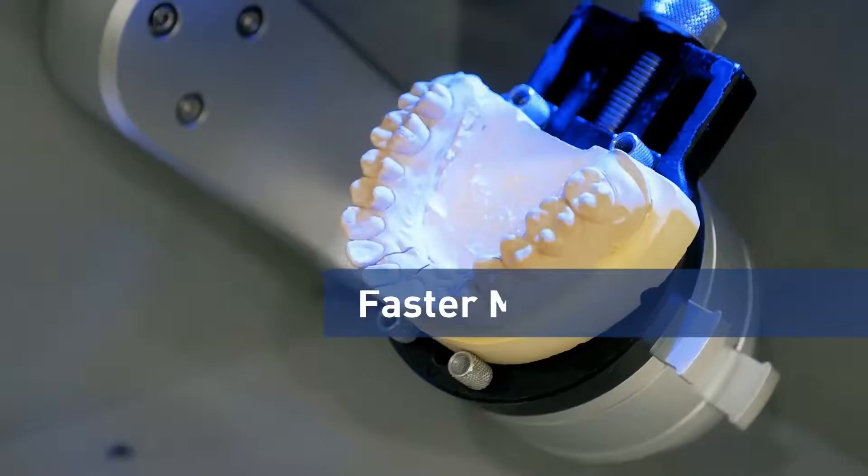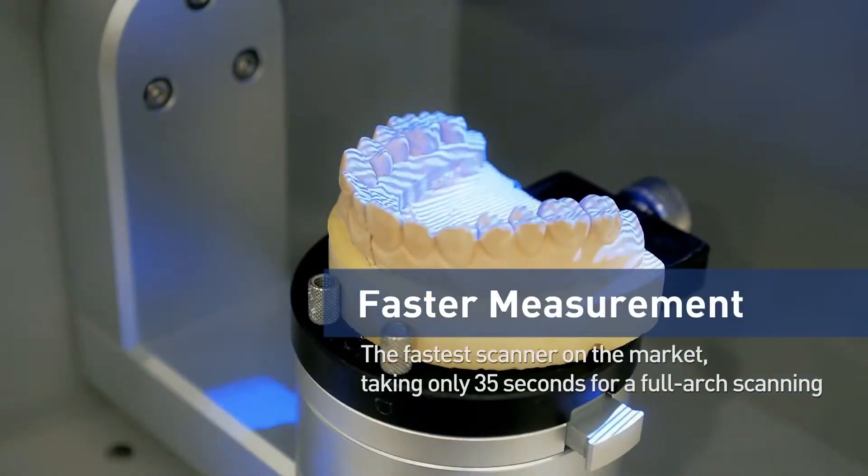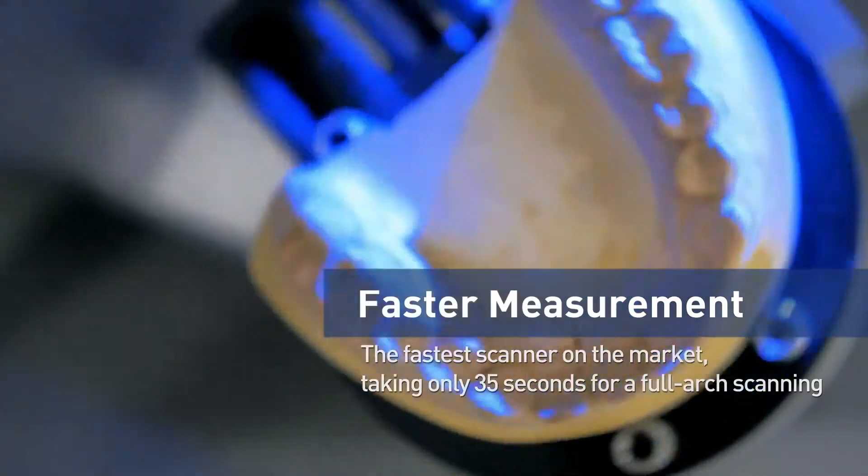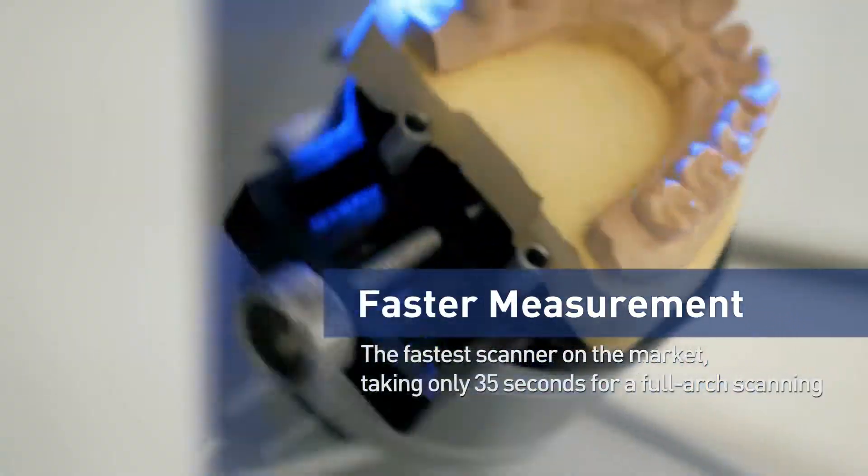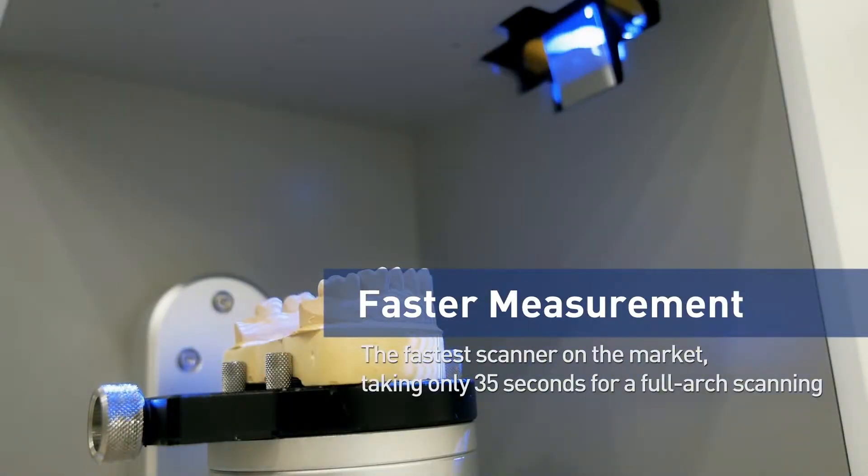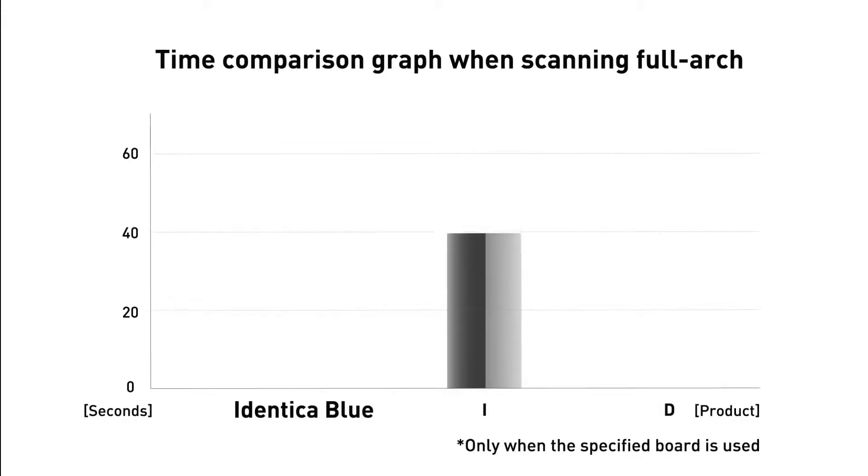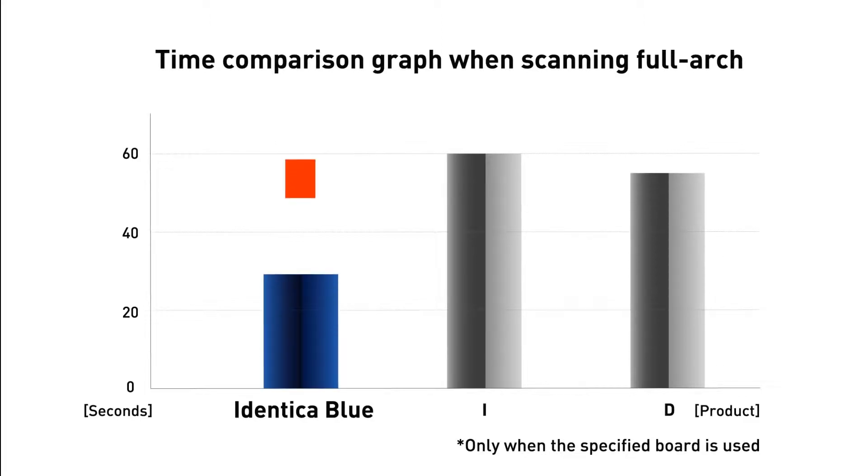Identica Blue 2015 is the fastest scanner in its market today. With the patented automatic scanning feature, scanning of a full-arch model can be accomplished in as fast as 35 seconds. It has been proven to be 30% faster and more productive than any other scanner in this market today.